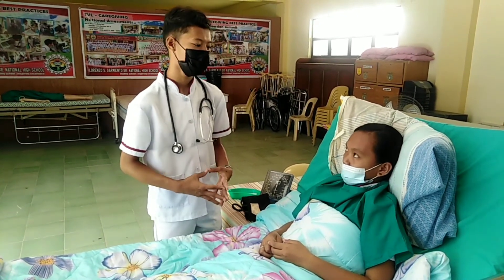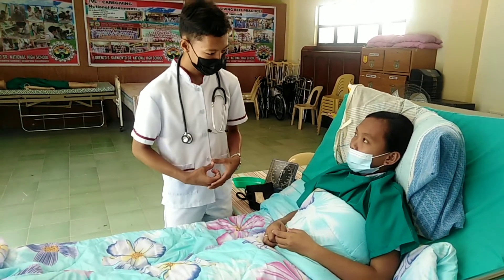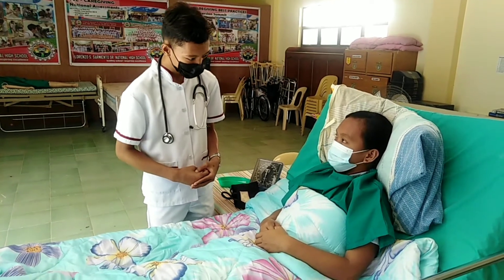Good morning ma'am. My name is Jolan Fernandez Filima, your caregiver for today. I'm here to take your blood pressure. Is it okay with you? Yes, ma'am.